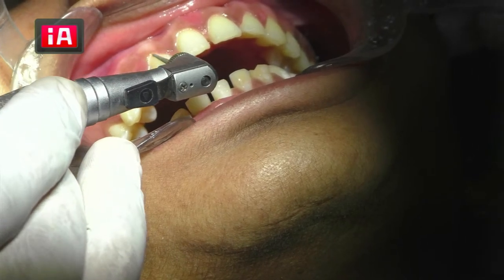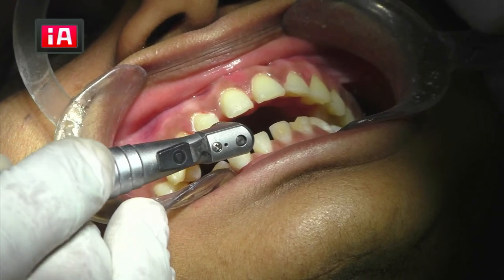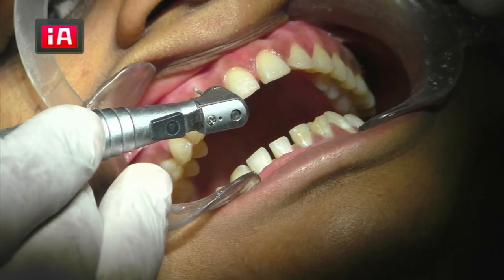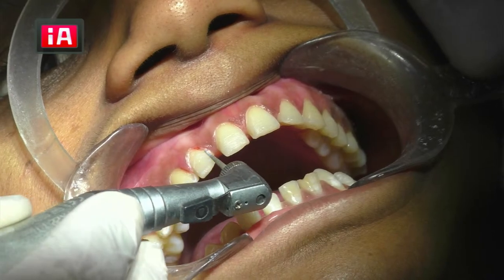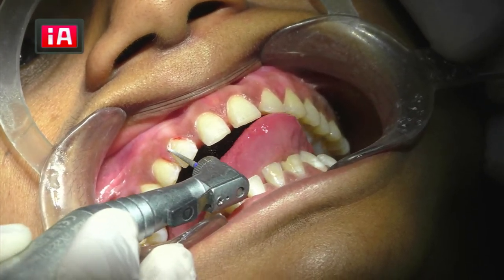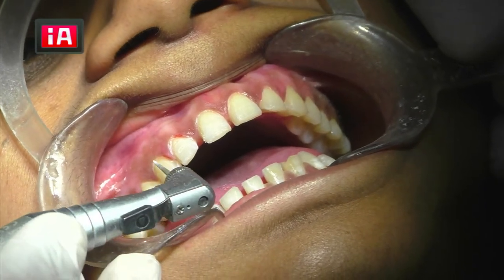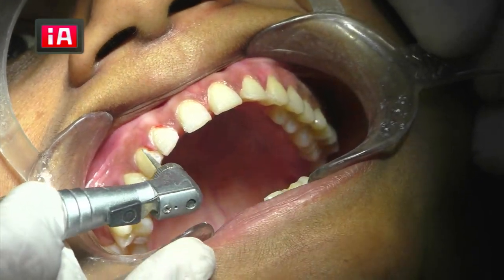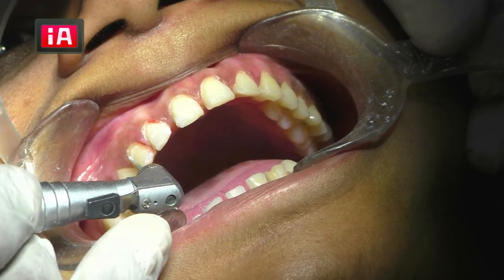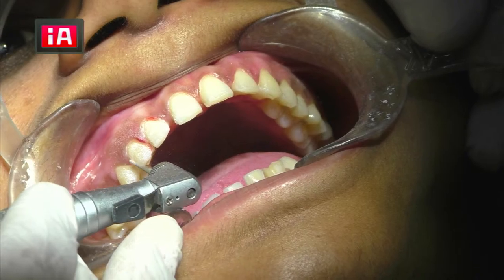That margin everywhere, you can finish using that. Now nicely you can dry it a little bit. Look, open. Dry it a little bit. See, the margin. There's no water, right? So you can see exactly where there is any undercut or rough surface. It is better to finish with the micromotor before going for a finishing bur.